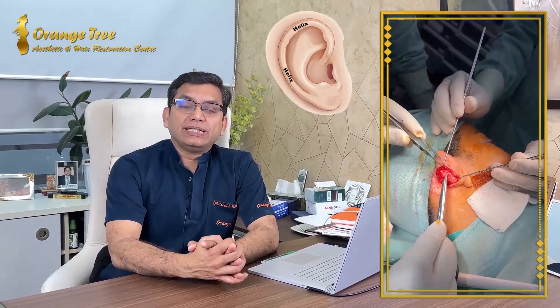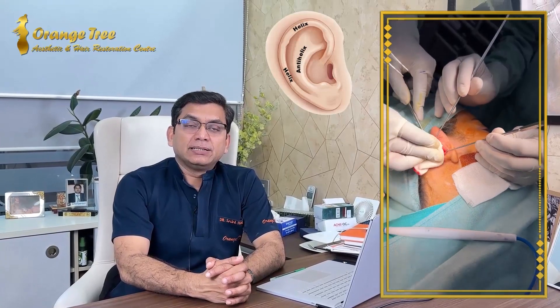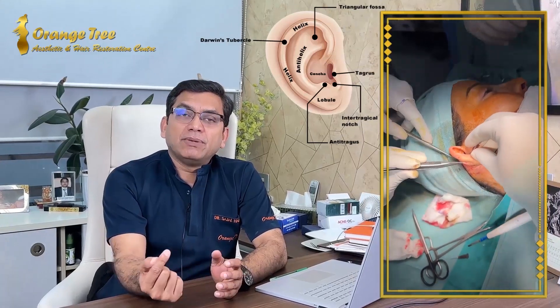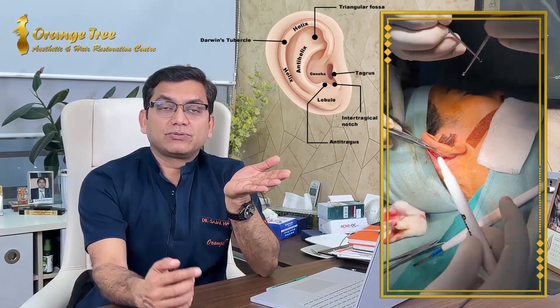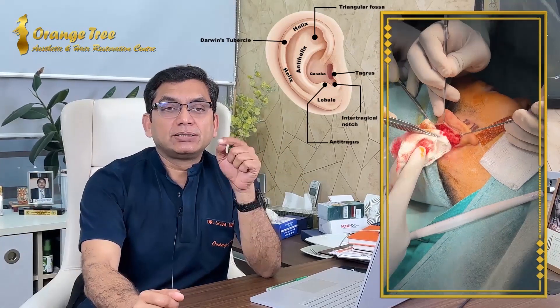Subperichondrially, we elevate the skin flap and try to identify the helical rim, preserving the root of the helix. The antihelix inferior and superior crura and the stem must also be preserved. Once we have identified these structures, we mark the antihelical rim by inserting a 26-gauge needle all along it to mark the posterior aspect of the cartilage, since we cannot see the anatomical structures from the posterior side. From the anterior side, we mark these important landmarks through the needle.